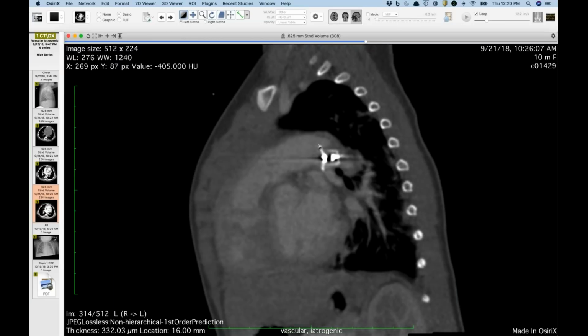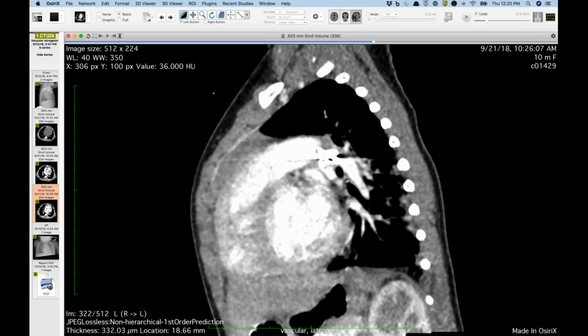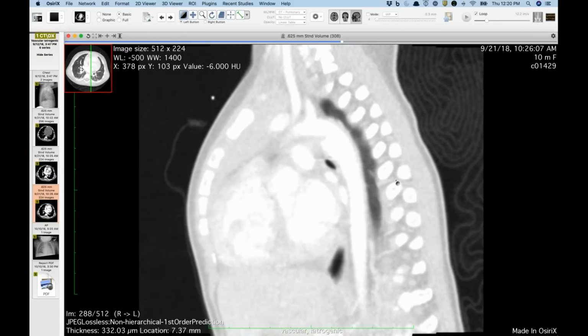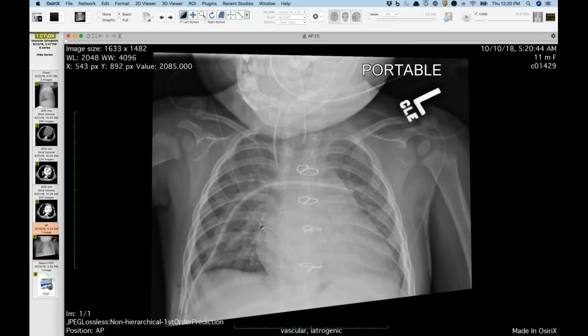It was because we've never really thought about the orientation of these, and it's so close to where you would expect it to be. But despite this, there was still filling of the pulmonary artery to the left lower lobe, so it was incompletely occluding. And I think this is just some dependent atelectasis from the acquisition of this study. They tried to retrieve this percutaneously and couldn't. So yesterday, they actually had to do a median sternotomy to remove this and to ligate the patent ductus.